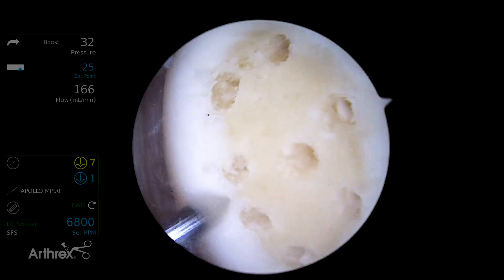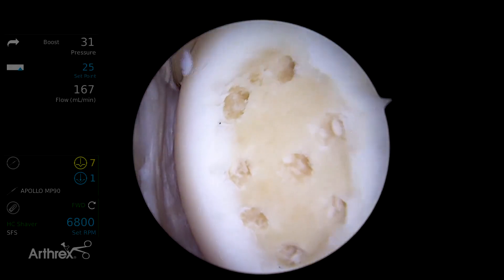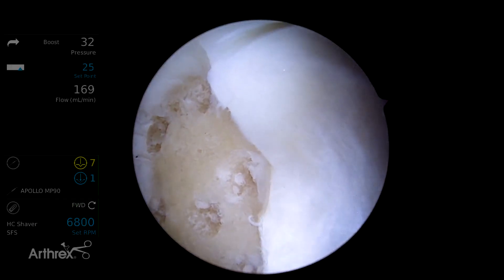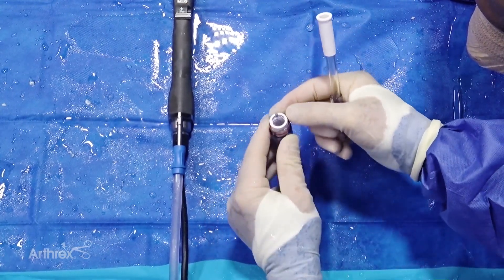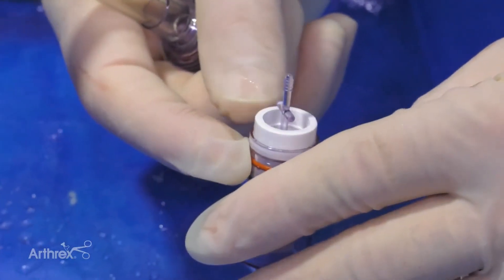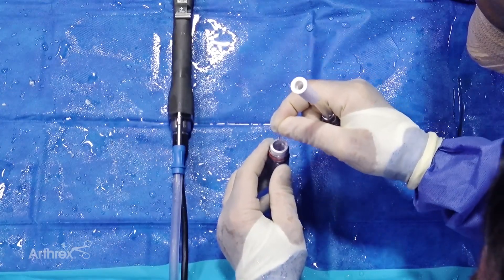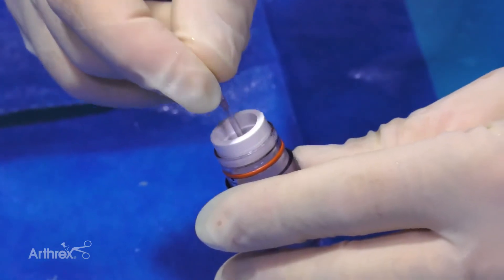You want to try to avoid confluence if you can. Not much more we can do here when you look at the defect, so we'll stop because we don't want to break down the surface too much — we'll just clean this out. Next, we're going to demonstrate the graft net.